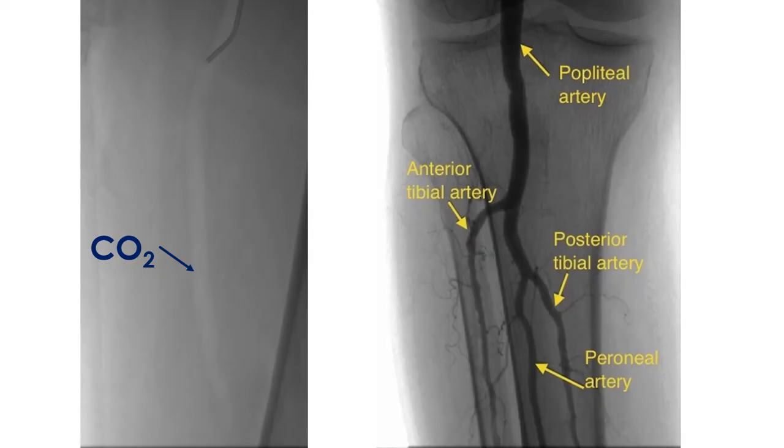Usual angiograms appear dark, while carbon dioxide angiogram looks grey because of the lower density of carbon dioxide compared to tissue. Conventional angiogram is shown beside the CO2 angiogram for comparison of opacification. Please note that the angiograms are not in the same projection. The better contrast with conventional angiogram is obvious. While conventional angiograms look like positive images, carbon dioxide angiograms look like negative images.